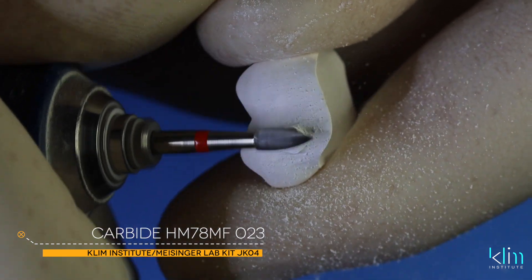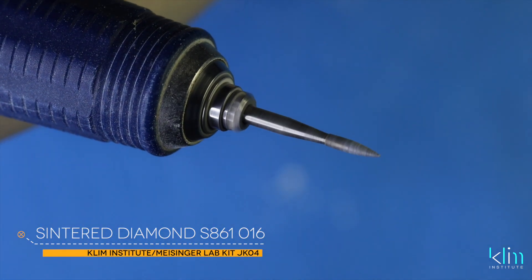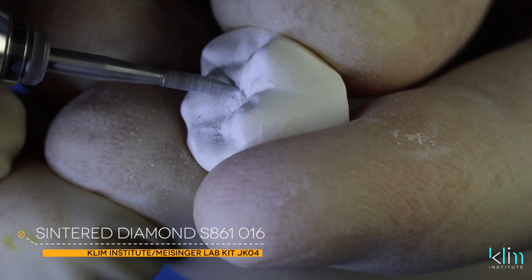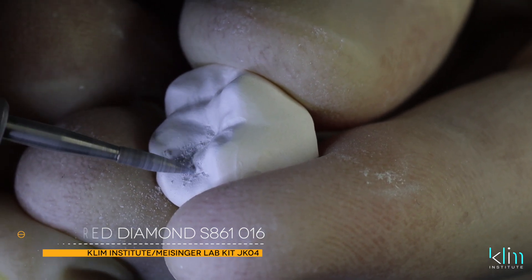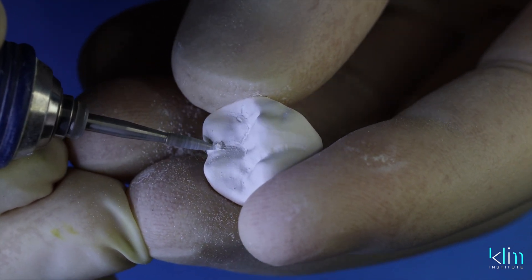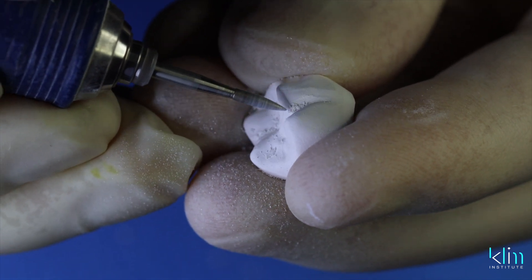The next step is to refine occlusal and external anatomies. For me, this is the small sintered diamond on the JK04 lab kit — the zirconia lab kit — at a slower RPM. Carve the occlusal and external groove anatomy as desired.